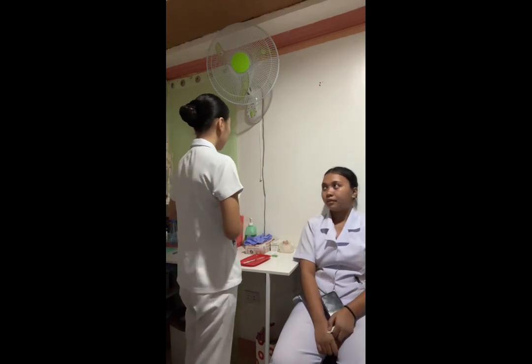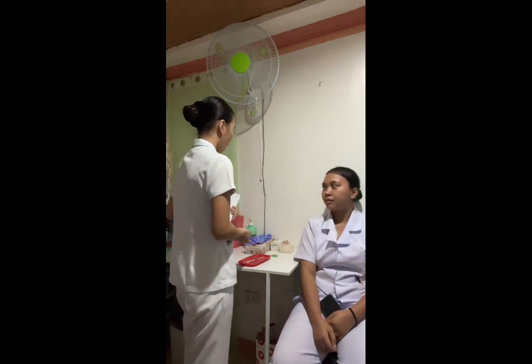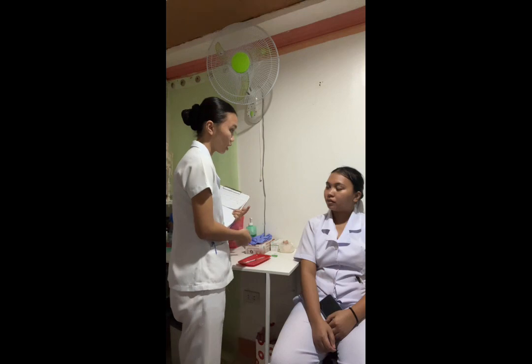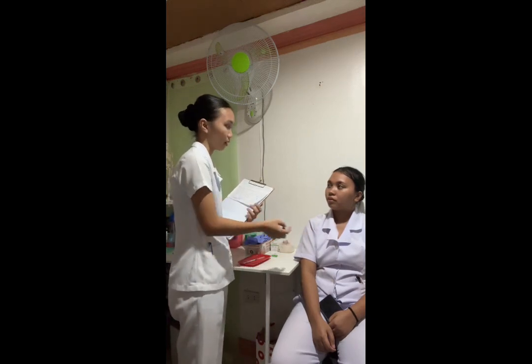So now, ma'am, your physician has ordered a penicillin skin test, and I will inject a small amount of penicillin in the skin of your forearm. With that, we will be able to know if you are allergic to penicillin. Would that be alright, ma'am? Mm-hmm. Okay, after the injection, ma'am, expect that there will be a bleb or a raised area on your skin after I inject this medication. It is just like the bite of a mosquito, in which there will be a small raise in your skin once you rub it. Okay?